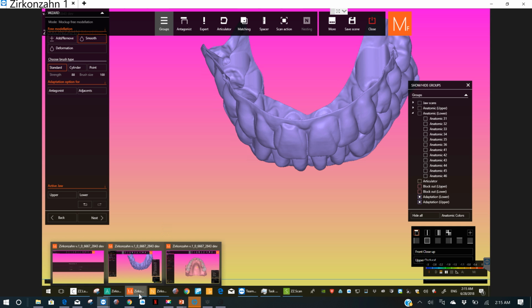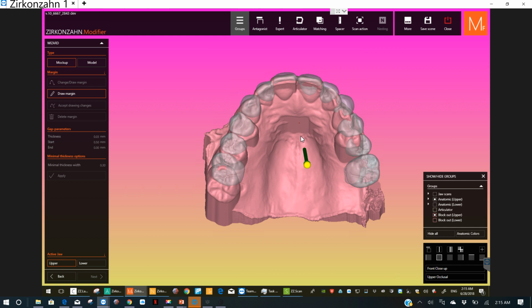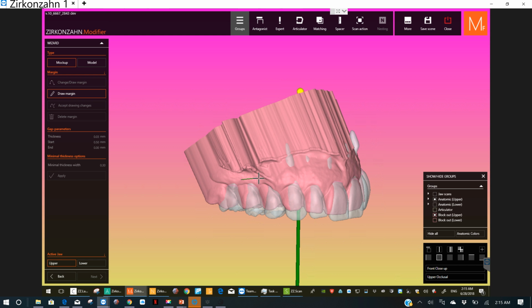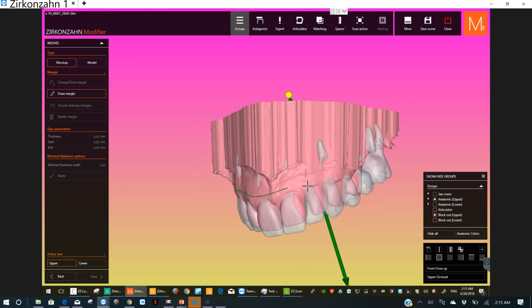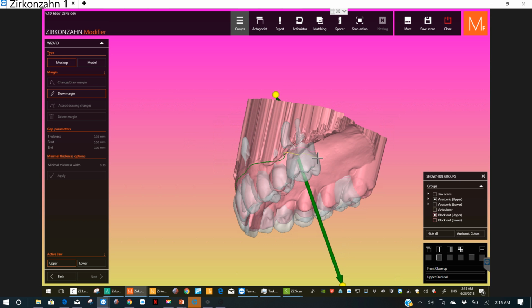Now let's go back to this one, and we're drawing our margin. So I just kind of went straight through that little area where we blended the roots in. If it won't let you move, this was very tricky for me for a long time. It won't let you move to the next step if you have a yellow spot when you're doing this, which means like that. So I'll do it on purpose just so you can see how to handle it.